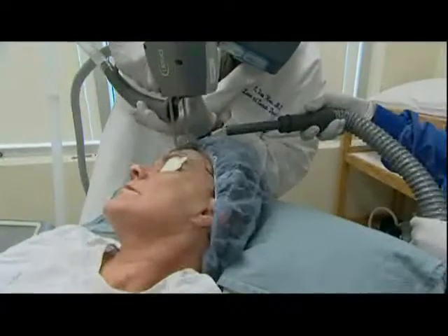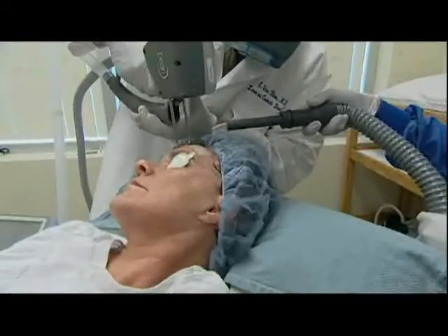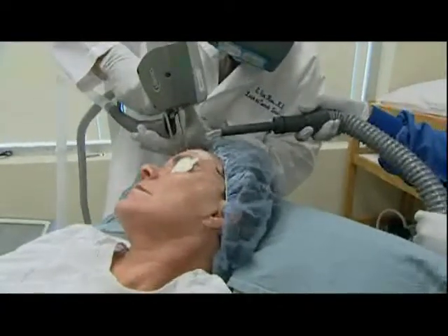The science behind the Pearl is that rather than using the carbon dioxide laser, which we've used for years, or the traditional erbium YAG laser, the goal was to find a hybrid wavelength where you could get the proper balance of tissue removal and thermal damage. Because thermal damage or heat damage to the epidermis is not always a bad thing. Within the context of the CO2 laser, it was often thought that there was too much thermal damage, and with erbium YAG there was too little. So almost like Goldilocks and the Three Bears, with the porridge, this is just right as far as the heat.